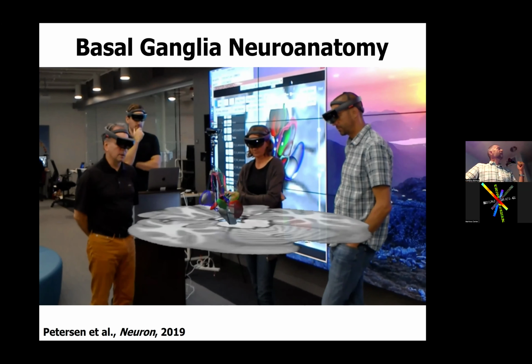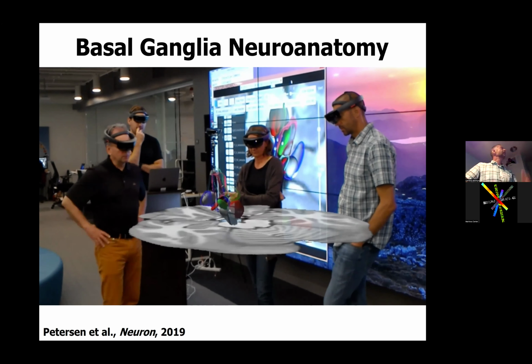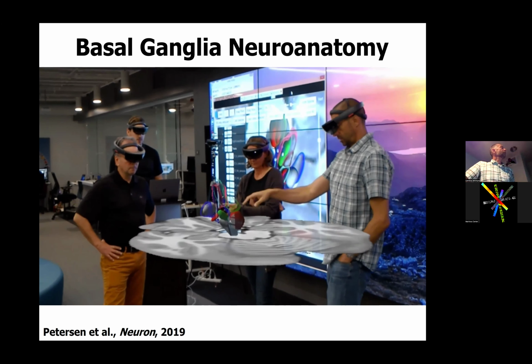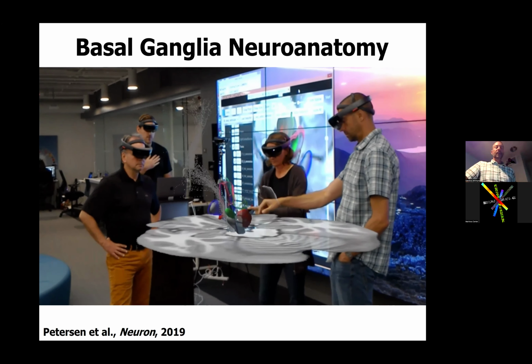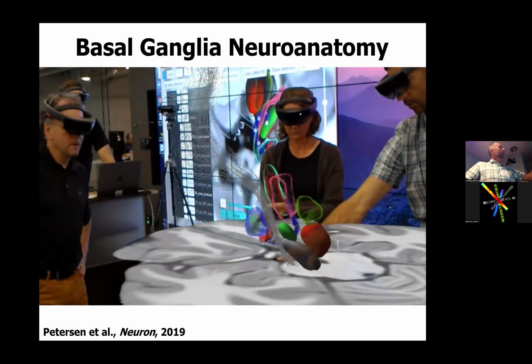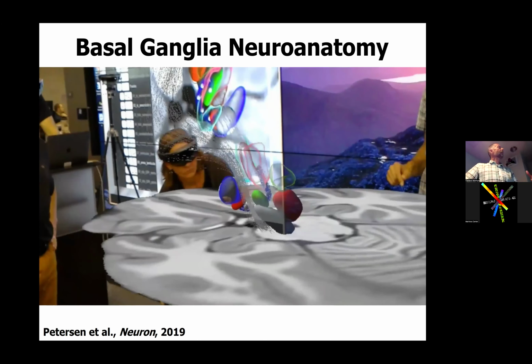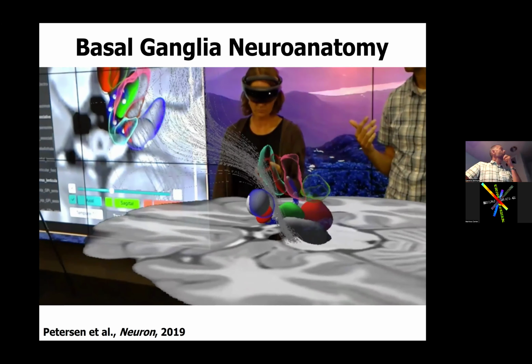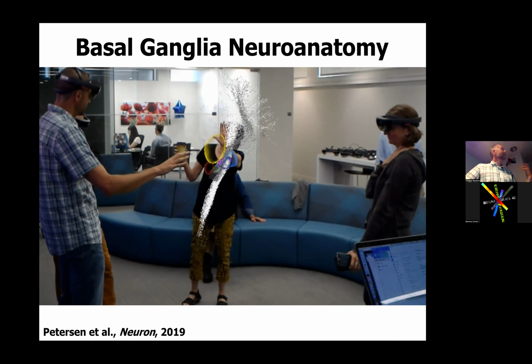And so when these holographic head-mounted displays started popping up from Silicon Valley, we thought, wait a minute, one cool thing that we'd love to be able to do with these data sets is build anatomical representations of all these different pieces and put them into the context of modern human connectome brain atlas space, right?